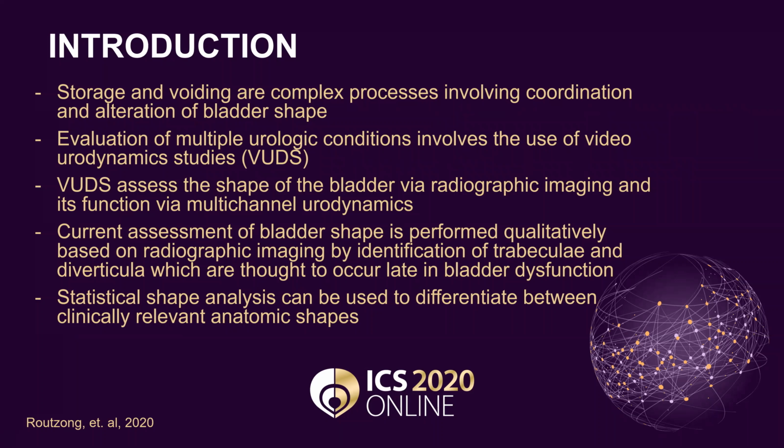Current assessment of bladder shape is performed qualitatively based on radiographic imaging by identification of trabeculae and diverticula, which are thought to occur late in bladder dysfunction. Statistical shape analysis can be used to differentiate between clinically relevant anatomic shapes.